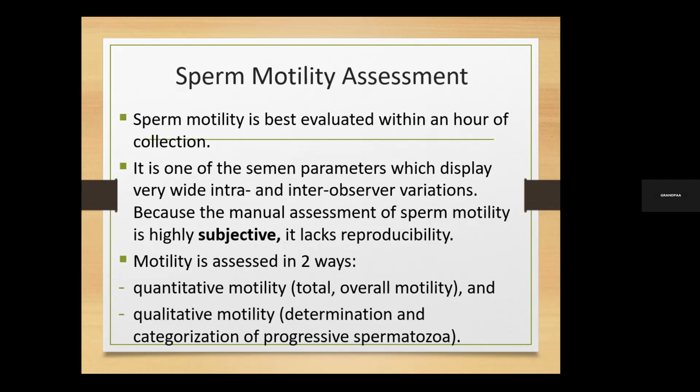But what is actually of significance is the sperm motility assessment. But remember, we said that the wave motion test is a characteristic of motility, because without motility, there will be no wave. And if there's no wave, there will be no wave motion test. So it is a characteristic of sperm motility. All right, so it is not out of place, right?